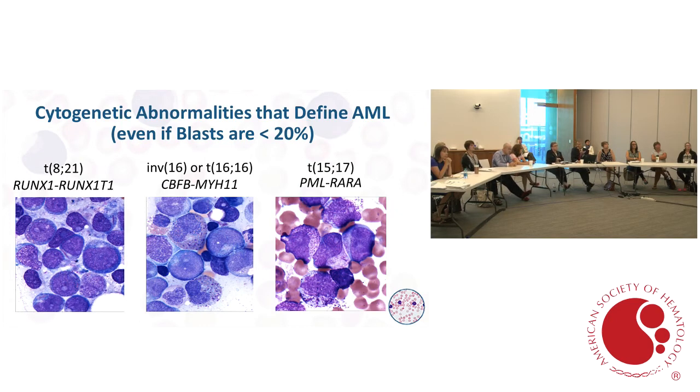In our lab, for example, I think we're an outlier, but our cytogeneticist, Paula Delchin, prefers to do a rapid karyotype in 24 hours, so we don't FISH up front unless the karyotype fails, or if it's unexpectedly negative, then we'll resort to that. Her rationale is that if it's negative for FISH, we have to do the karyotype anyway, so we'd rather just get it over with and do the karyotype, especially if it's likely to be positive, and then they're finished with it. Our clinicians would like us to do both, the rapid karyotype as well as the rapid FISH.